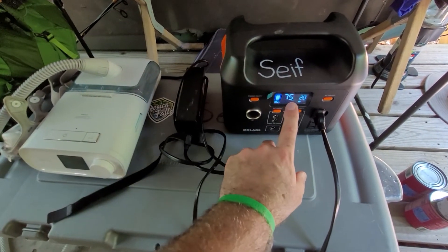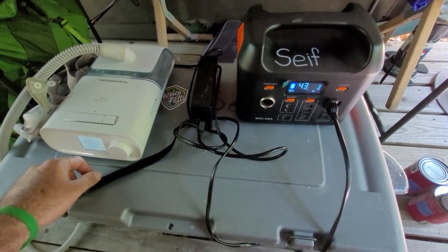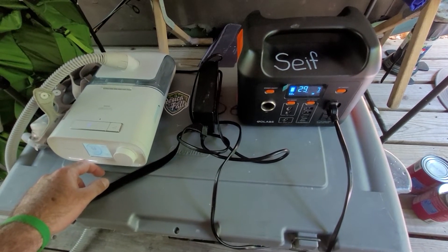It's going to tell you how much time is left approximately. I'm going to turn on my DreamStation, which has been recalled, but I've been promised a new unit is coming.